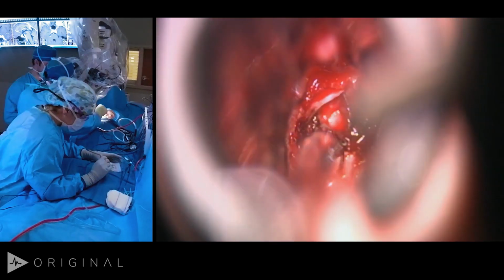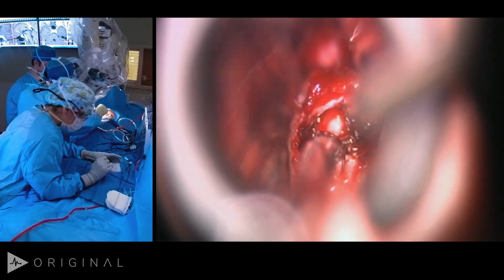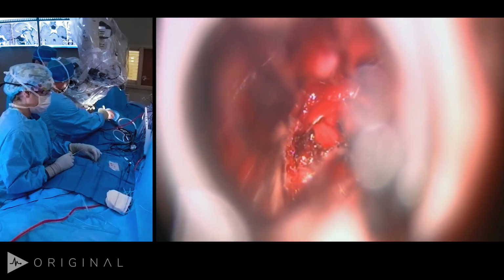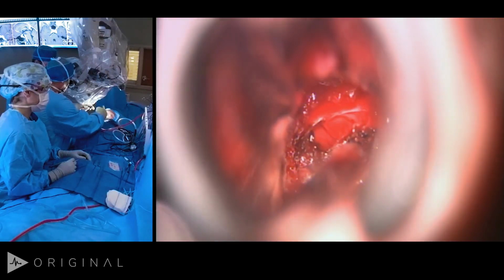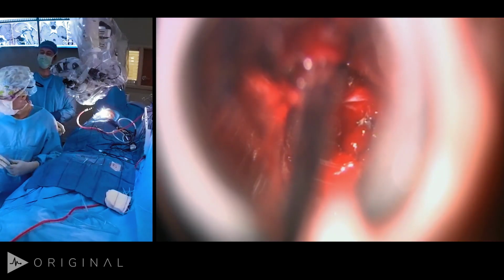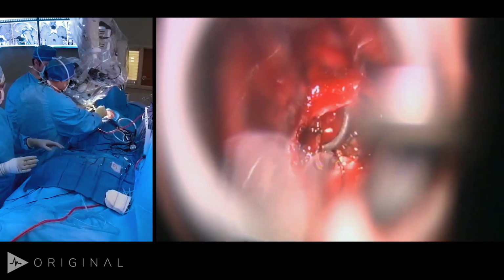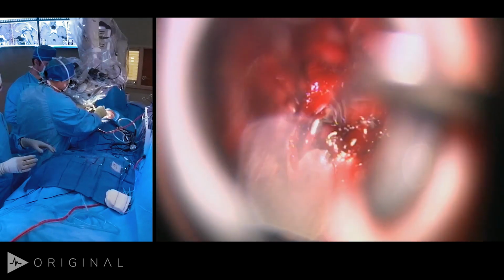So looking through the ring, we can see posterior gland, there's white. The anterior gland is pink. I think you can see very nicely the differences between the two. We have a small punch. The anterior lobe is divided into two, it seems, part of it hanging down. There's no CSF leak, and probably we're close to being done here. We'll try one larger ring curette. I doubt I'll be able to get it in, but we'll try it anyway just to see if we can. Oh, there we go. Just to make sure we've gone all the way over lateral, which was our primary target.